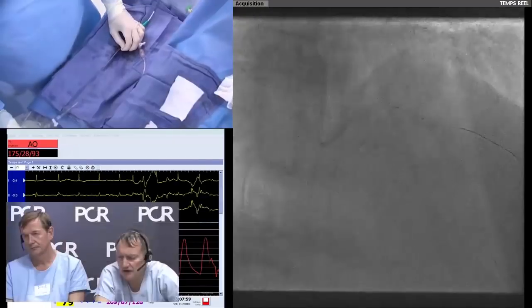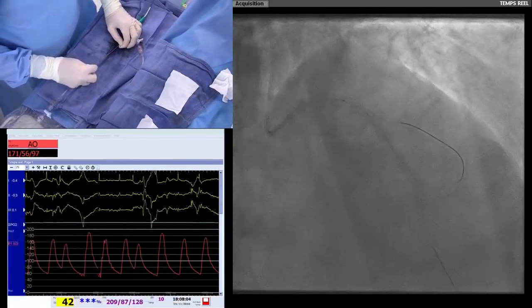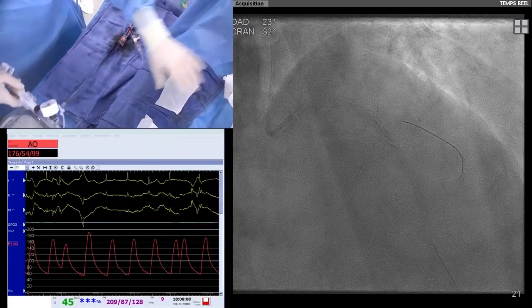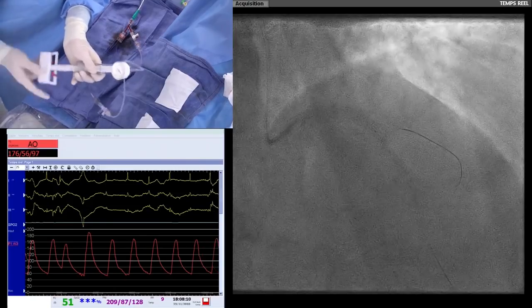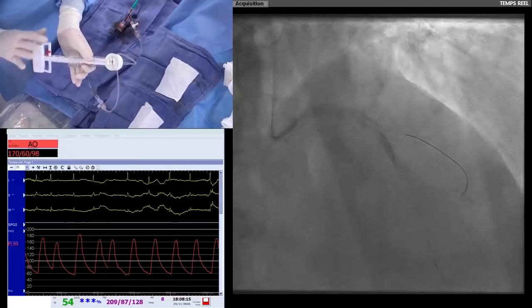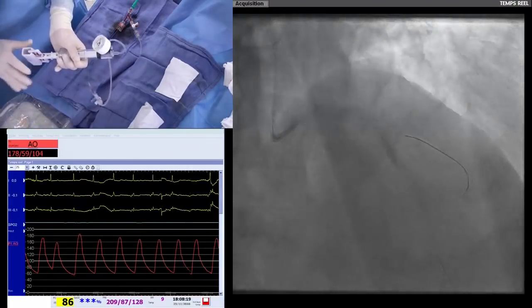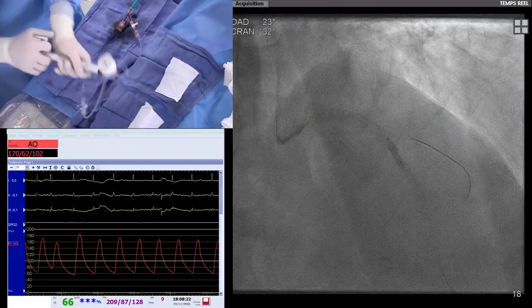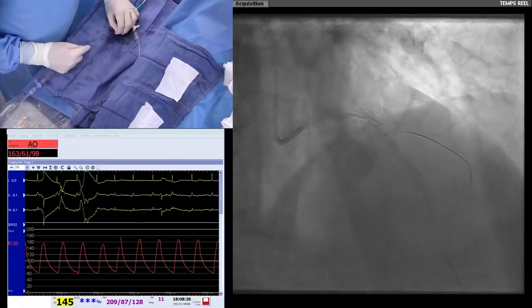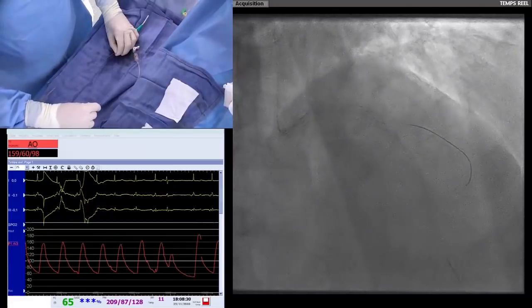I have the 3.5, okay. Yes, I forgot because we are discussing, and I have to perform a post dilatation also of the left main, in the overlap between the two stents. So first, I perform an inflation using a 3.5 balloon at low pressure. This is 6 atmosphere. I think it's okay. Just in the overlap part, and then I will perform a POT more proximal. Okay.